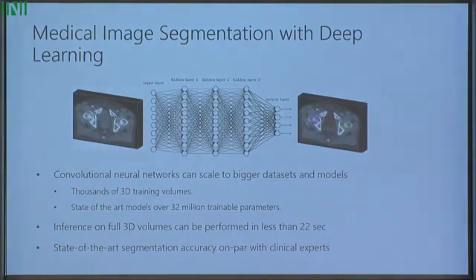So as I mentioned, when we started the InnerEye project, our first model was trained over 50 images, which is why the research was driven by how does one do effective learning from a very small number of images, which also led to the research on decision forests. Today we have ingested more than 50K images from a variety of partners, and we are training models with almost 1,000 images. And so needless to say, we are developing robust deep learning technology for medical image segmentation and beyond.